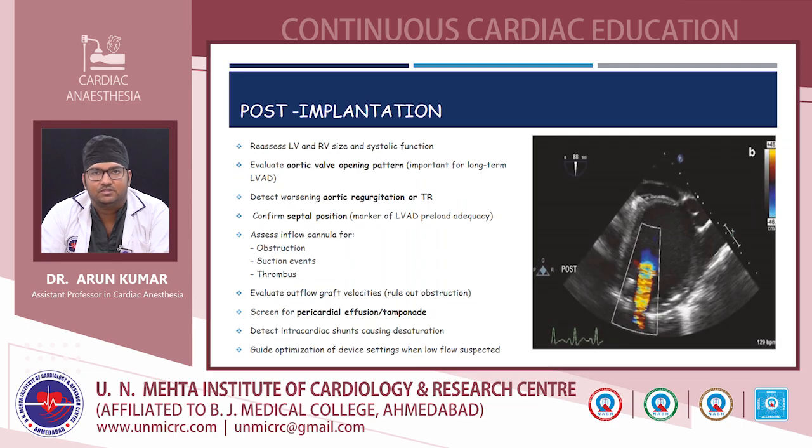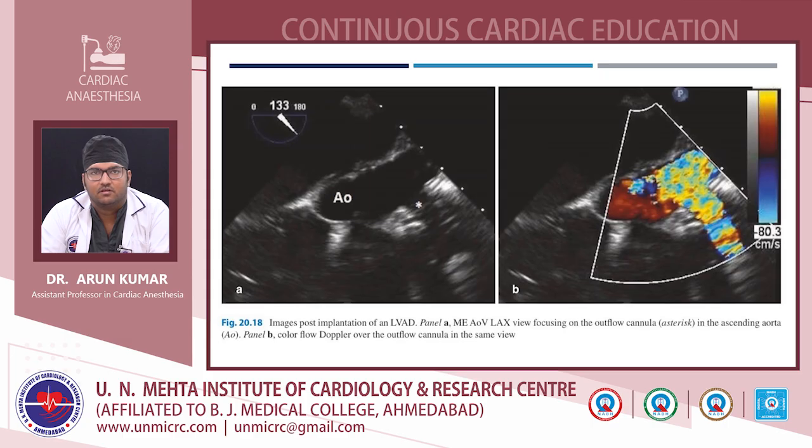This is the same image which I have shown in the previous slide. This is the color Doppler showing the inflow from the inflow cannula to the LV apex. So this is another image of LVAD post implantation, mid-esophageal aortic valve long axis view, showing the outflow cannula and showing the laminar flow into the ascending aorta.